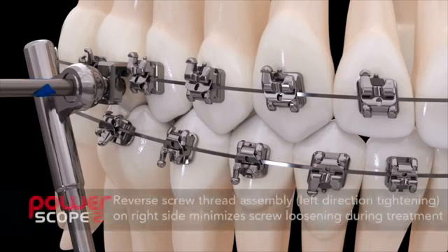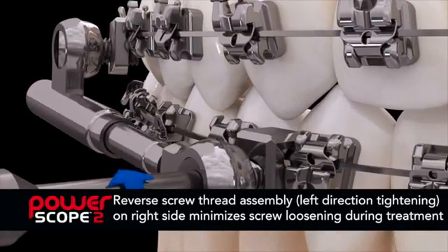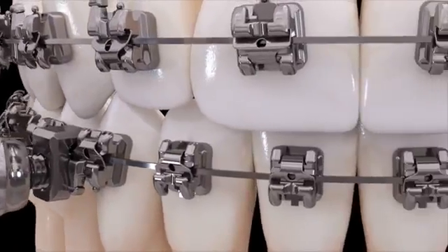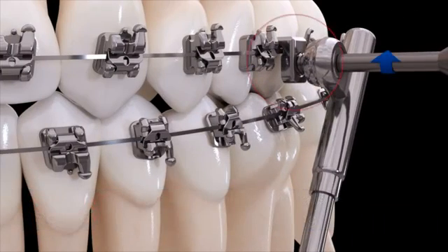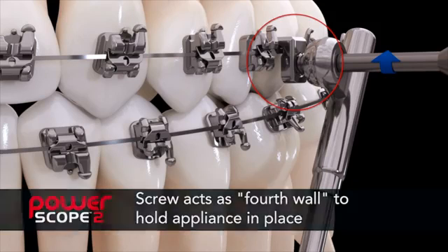During installation, screw loosening during treatment is minimized thanks to a reverse screw thread assembly used on the right side appliance. This means the device tightens by turning the screw to the left instead of the right. The left side appliance installs with the traditional right hand direction. You can see PowerScope's wire attachment nuts hang on the arch wire, and the screw in turn acts as a fourth wall to hold the appliance in place.